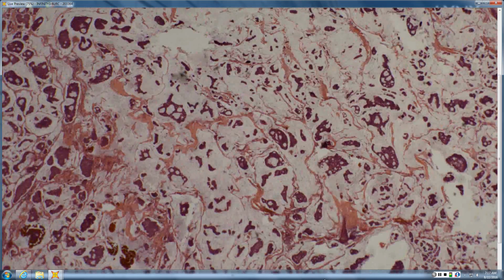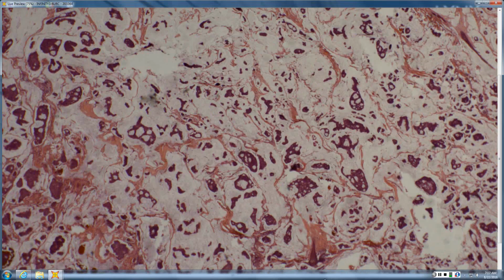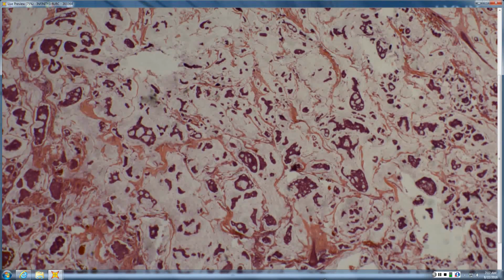This is a mucinous carcinoma. It's a great example of it. This is blue islands in a sea of mucin. We just had one of these the other day. I think, was it you that you brought? Yeah. And wasn't even expecting it because they can look like a lot of random weird things. And they certainly are primary in the skin on the eyelid and the head and neck area, but they're certainly metastasized lesions as well from internal breast and GI cancer.